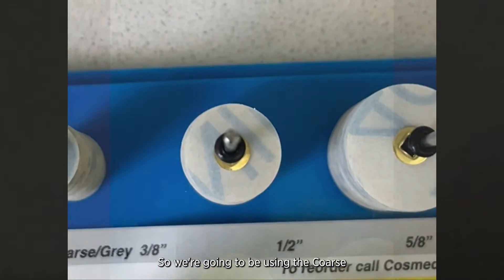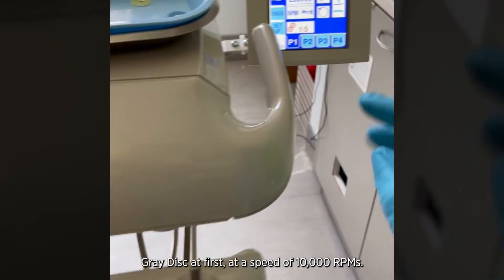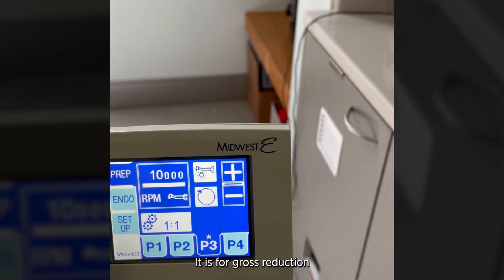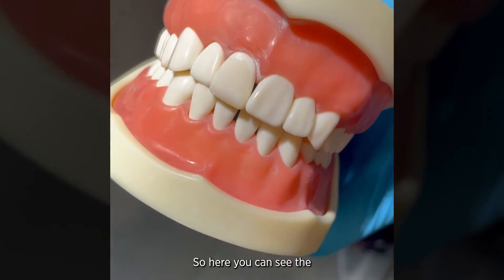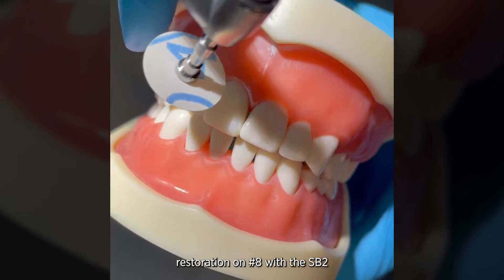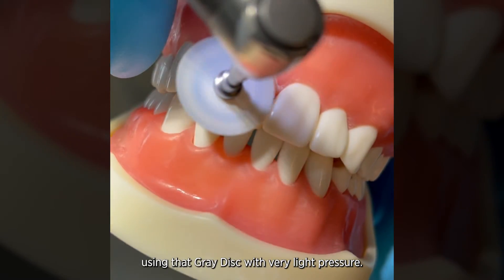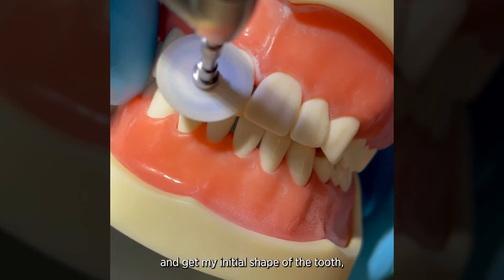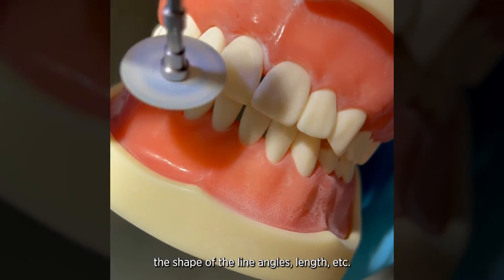We're going to be using the coarse gray discs at first at a speed of 10,000 RPMs. With this disc, the key is you really want to use light pressure. It is for gross reduction and for the initial contouring of your restoration — the shape of the line angles, length, etc.